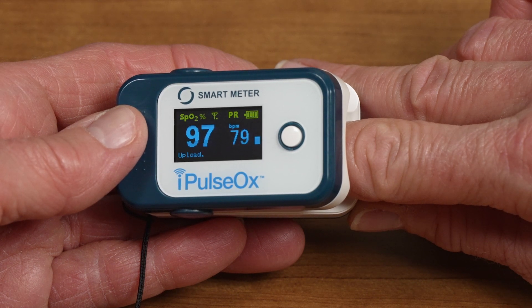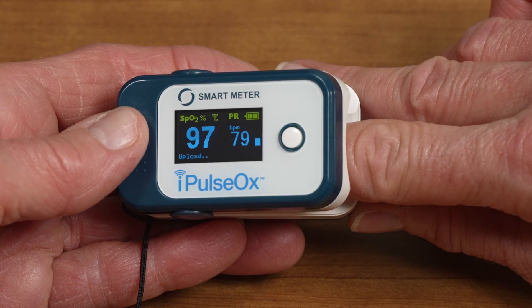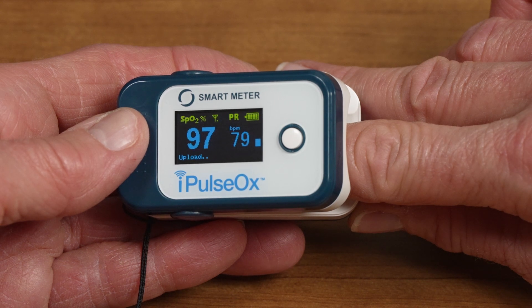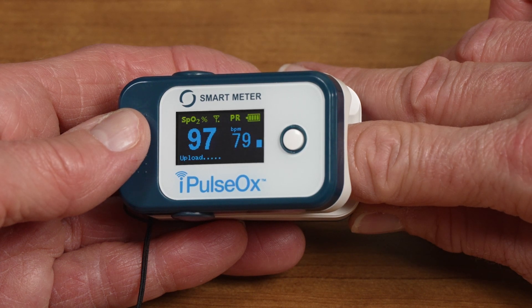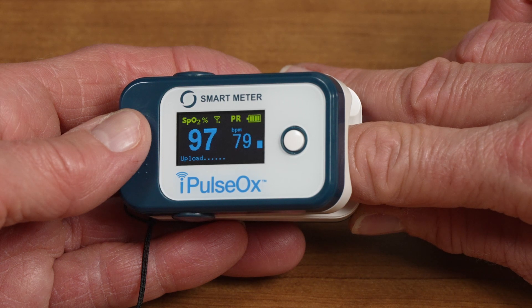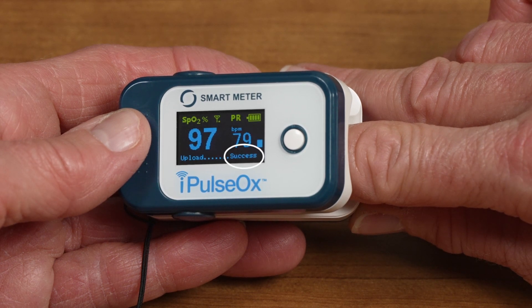Once the measurement has been completed, the device will begin to transmit the data over the cell network, which should take about 30 additional seconds. When the data has been transmitted, you will see 'Success' on the bottom of the display screen.